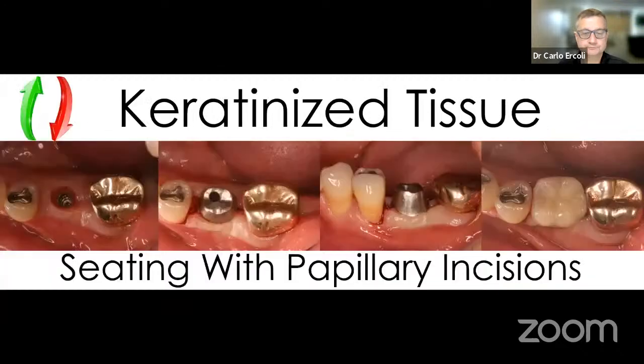Again, you can see the same in the mandible right here, where if you go from the left to the right, the left is soft tissue as shaped by a healing abutment. Very simple incision in the papillary area, and you can seat your abutment. In this case, it is a cement retained crown. But if it was a screw retained crown, the entire crown abutment assembly could be seated at the same time. And again, here it heals extremely rapidly and well, and more often than not, there is no need to suture those papillae back again.